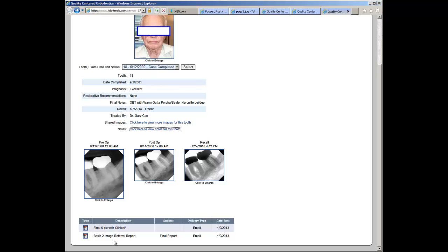As you can see, using TDO, you have nearly immediate communication with your referring doctors and all it requires is just a few clicks of a mouse. No other endodontic software has this functionality.